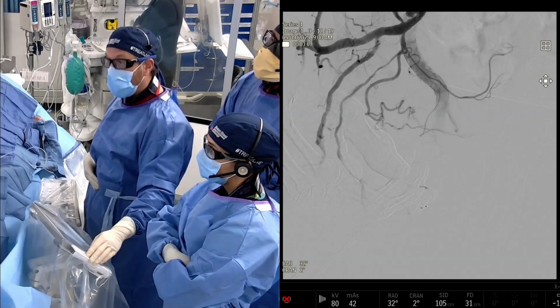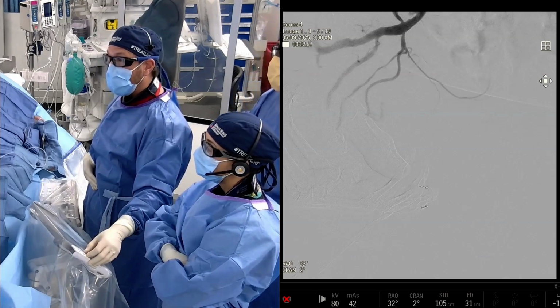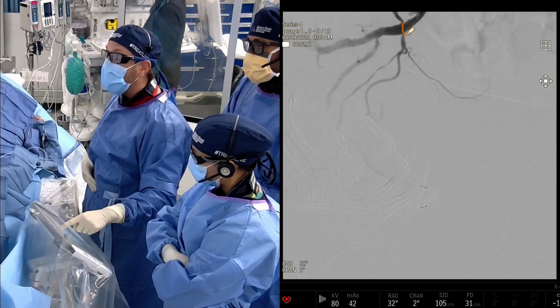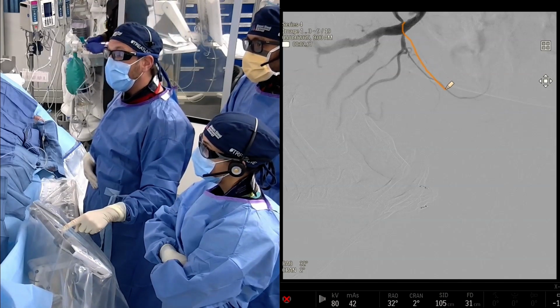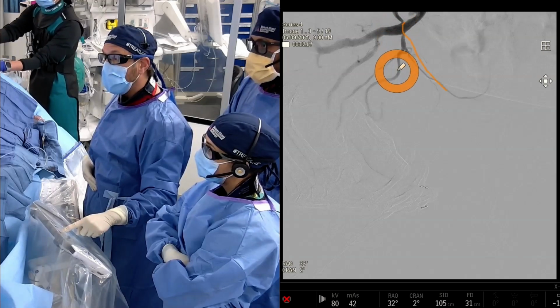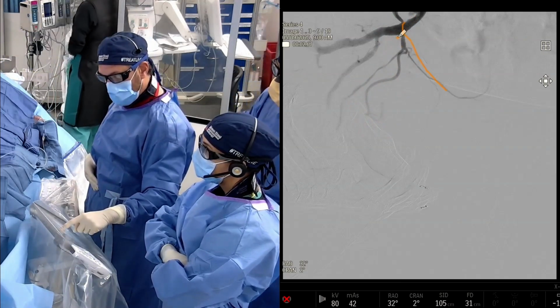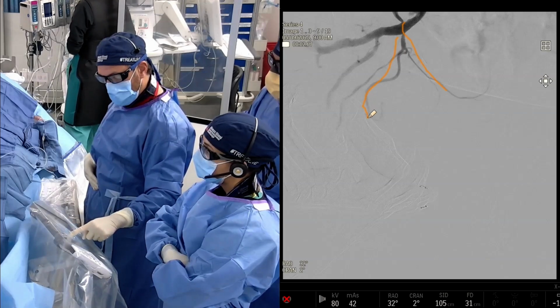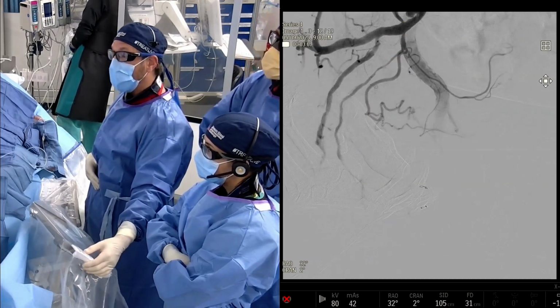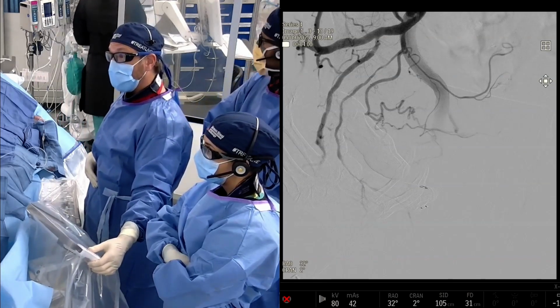And then higher up, we have a couple branches off that common trunk there, which is right here. This artery here, the umbilical artery, and then this artery here is a very large prostatic artery. Let's see if I can do that again. There we go. So we're pretty sure that that's the prostate artery. I don't think there's any debate there. And you can see all of those branches going to the prostate, which hopefully we'll be able to demonstrate in a few minutes.